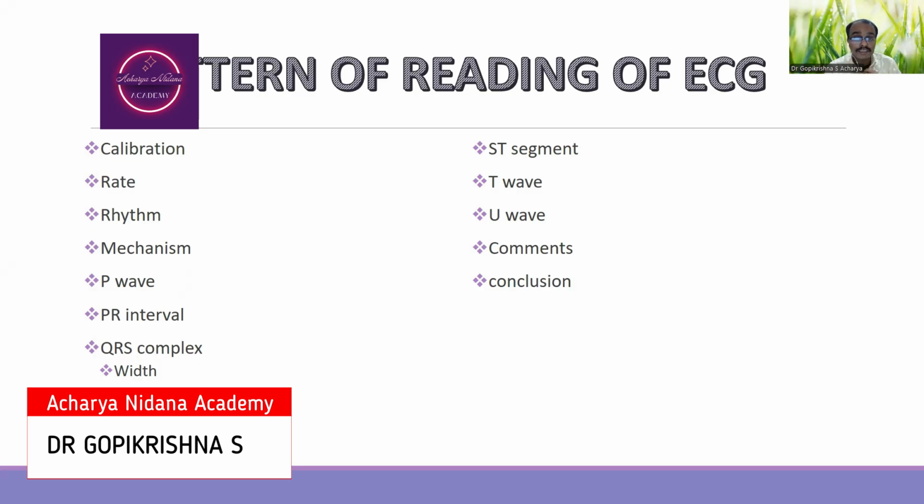If a U wave is present, the details of the U wave, comments and conclusion, plus additional remarks can be recorded in this reading of the electrocardiogram.